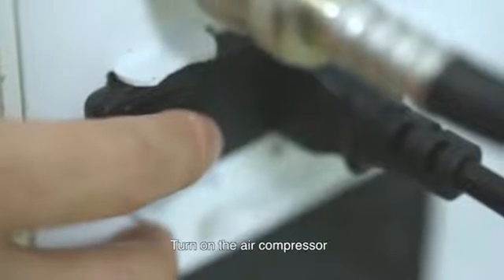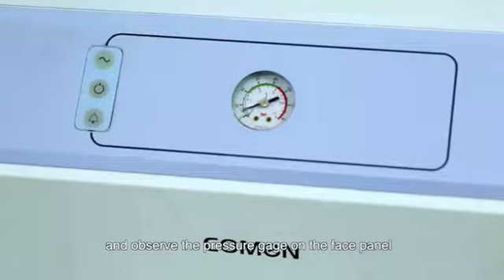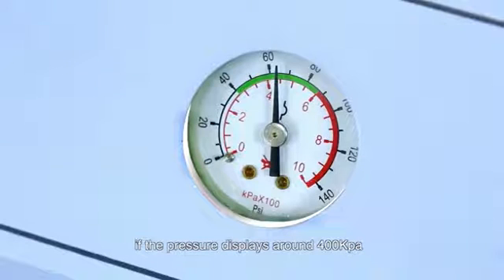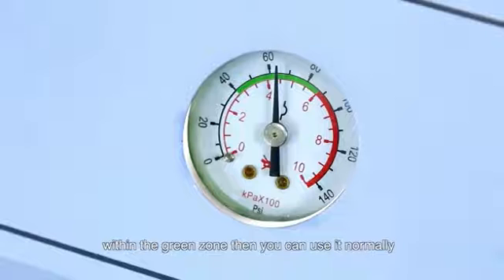Turn on the air compressor and observe the pressure gauge on the face panel. If the pressure displays around 400 kPa within the green zone, then you can use it normally.